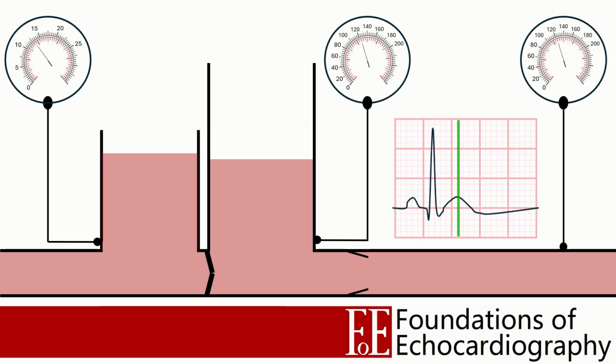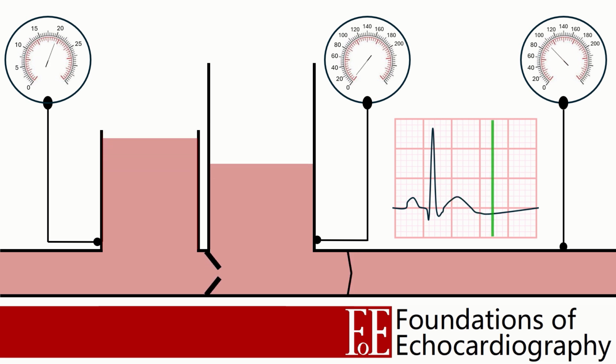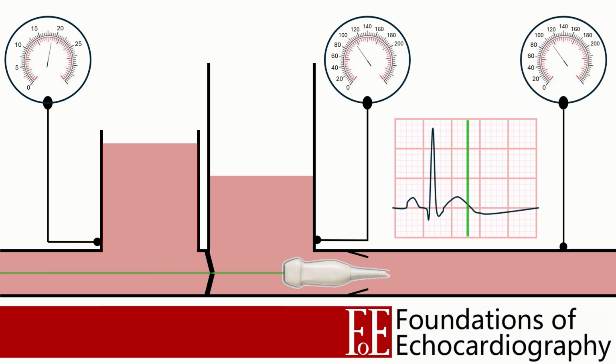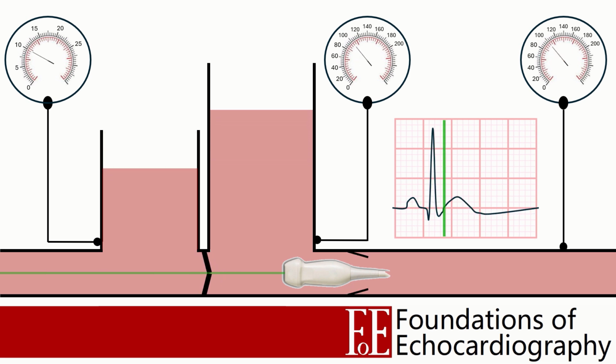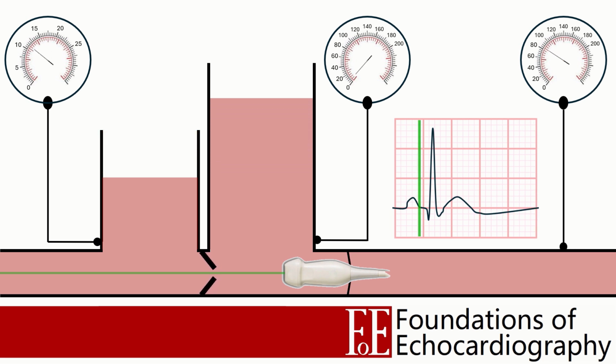When we previously looked at transaortic flow, we used continuous wave Doppler to help grade aortic stenosis, and we use a similar technique to help assess stenotic mitral valves. Staying in our standard apical four-chamber view, we place the cursor through the center of the orifice and, as best we can, align with the direction of blood flow.